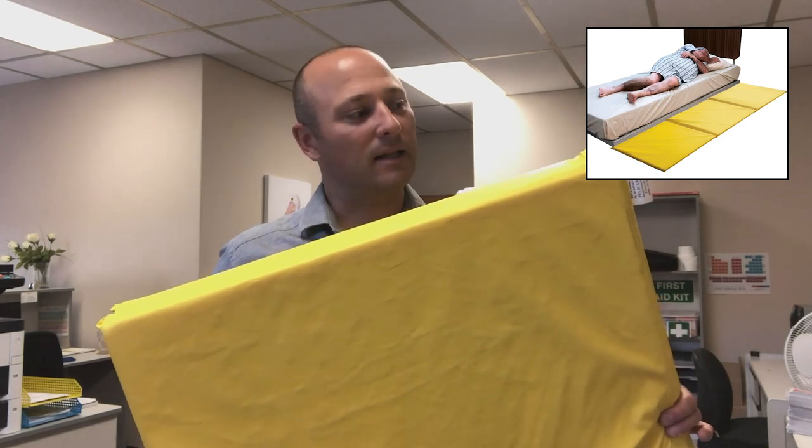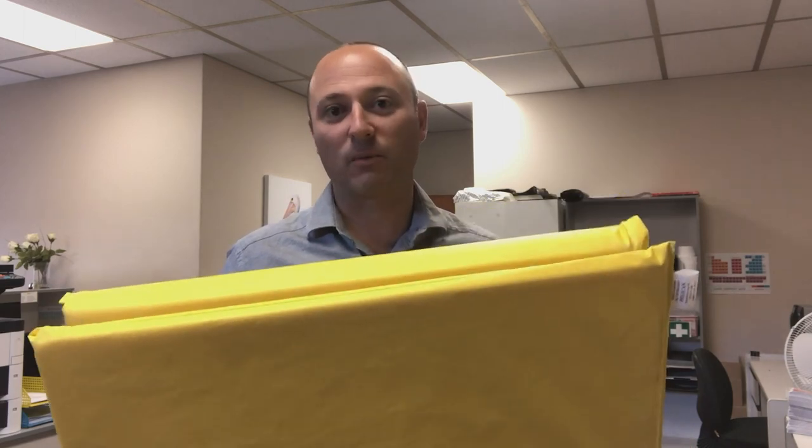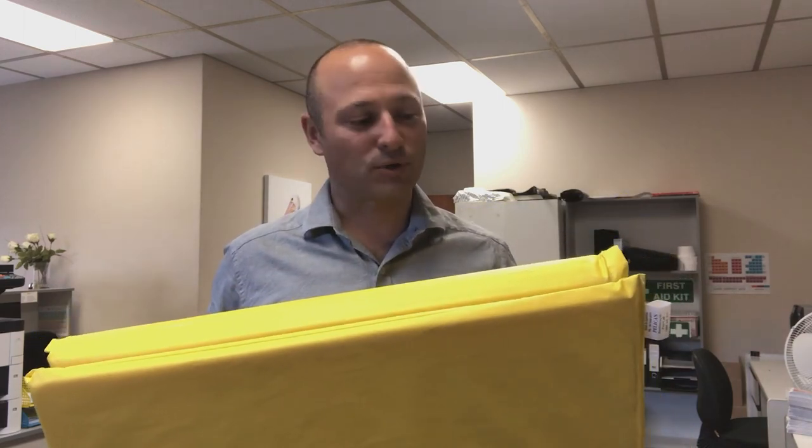Hi, it's Tom here from Pelican with another new product update. This is the budget bed format. Lately on the market there are quite a few very cheaply priced imported bed formats, and we're trying to come up with a product to compete at that price level.